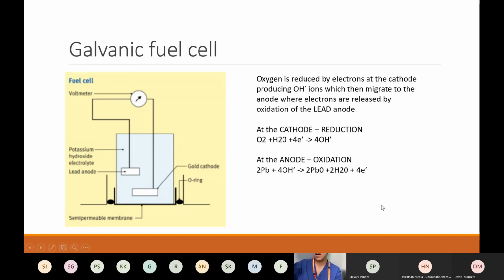So the example that was given is that it's on the anaesthetic machine, and you might see in the mornings the ODPs will have unplugged it and left it to calibrate. So it calibrates to air, which is just 21% oxygen, of course, and then it's plugged back in. But if it's left on the shelf for storage, it needs to be sealed in nitrogen so that it doesn't start reacting with the air, because then it will be consumed and therefore no good.